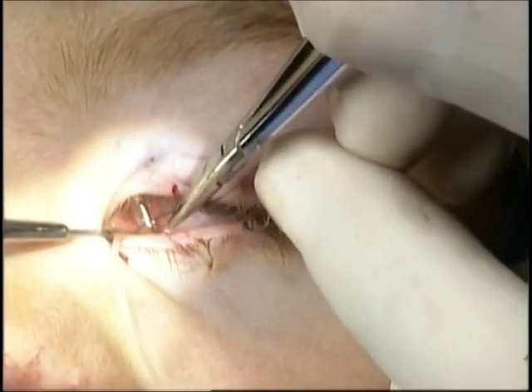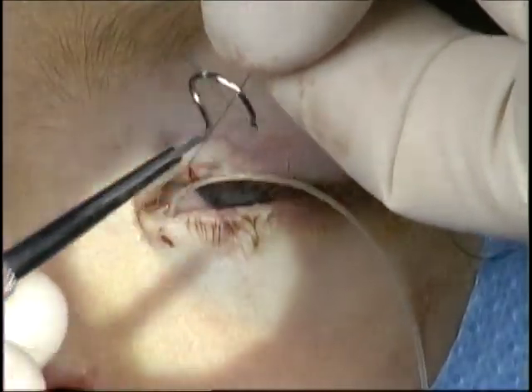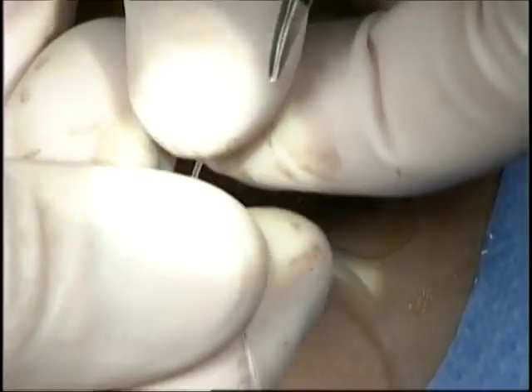A 6-0 nylon suture is then placed through the eye of the pigtail probe and rotated through the lower punctum. The other end of the Crawford stent is then placed over the nylon suture.